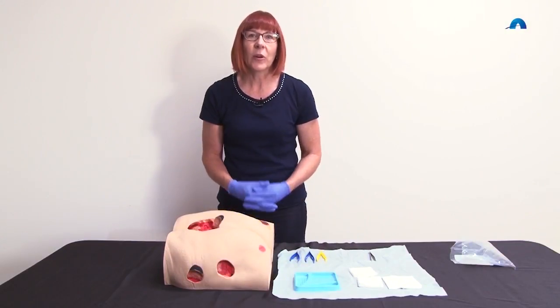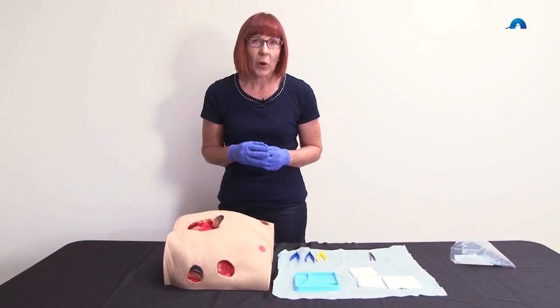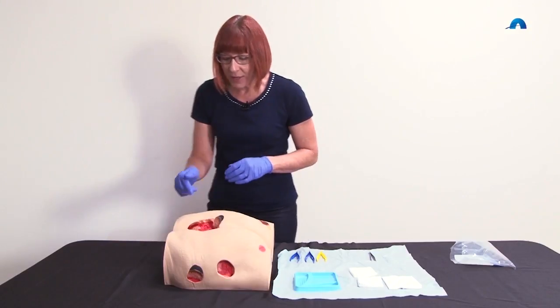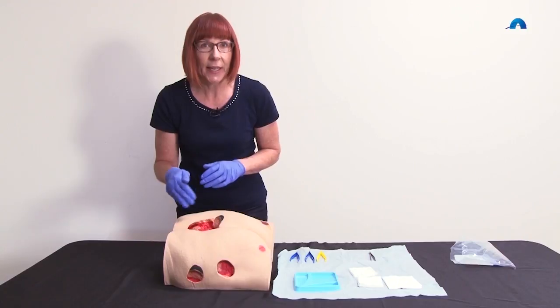In this demonstration, we're going to look at wound cleansing and debridement. We're going to use our simulated wound model and look at this sacral pressure injury here.